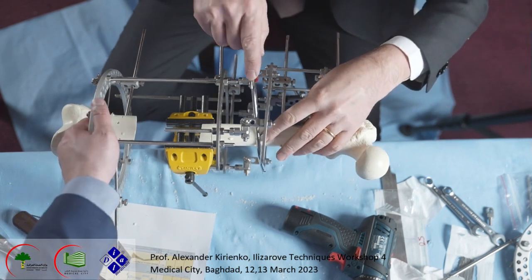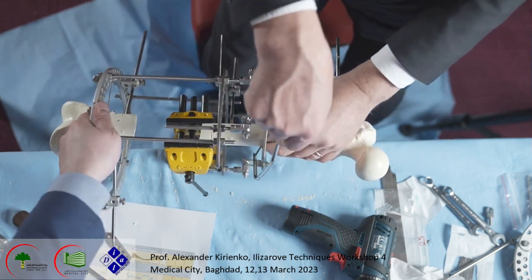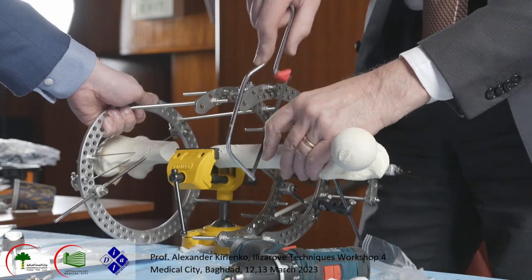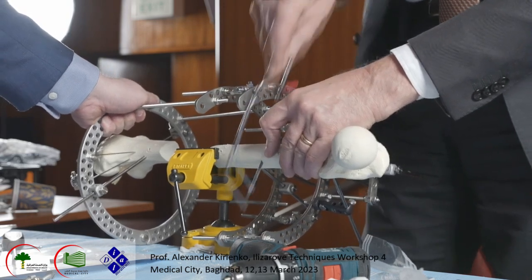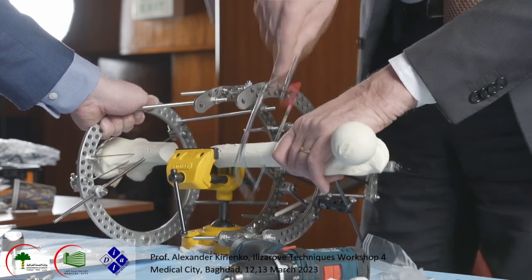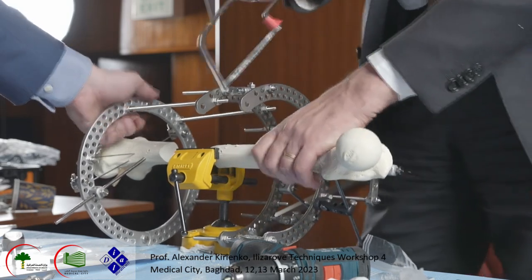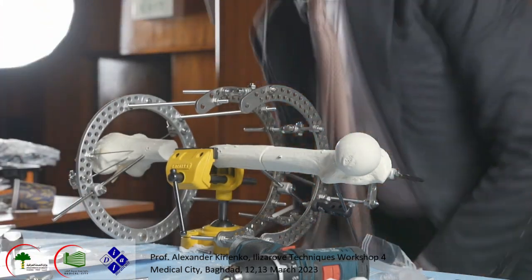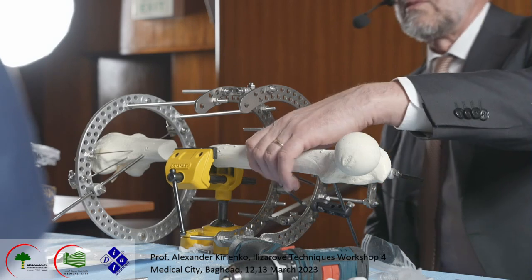Okay, I do osteotomy here, if you agree with me, from the medial side like this. Not so easy. Okay, I do osteotomy. It's not important, it may be transverse, it may be a little bit oblique. Yes, like I said before, I always use an osteotome. I don't do pre-drilling, I don't use the drill for making holes in the bone. I prefer to do only acute osteotomy with the osteotome.